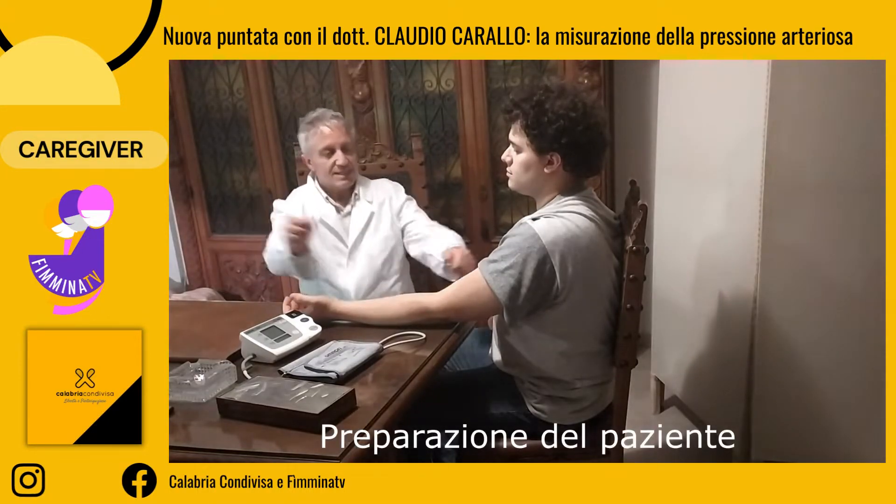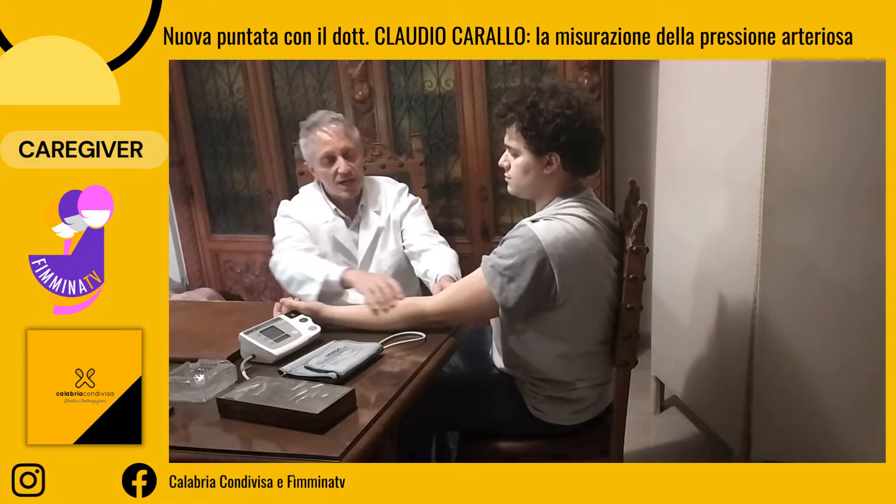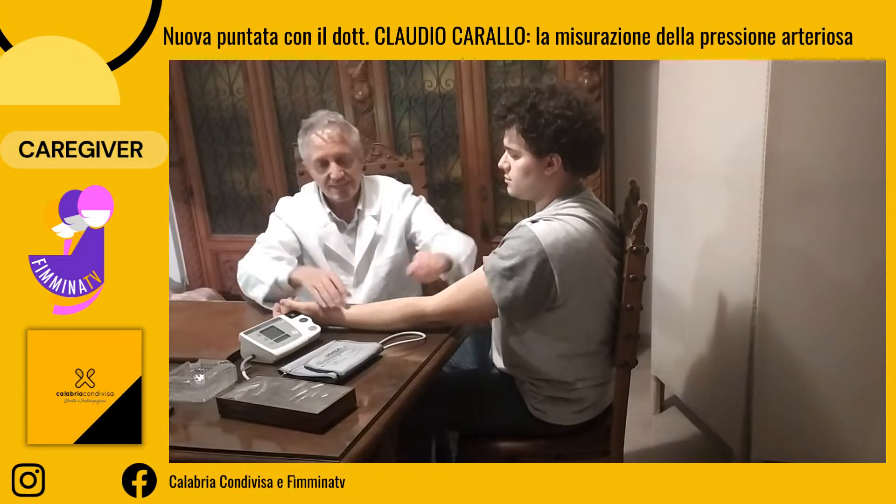Il braccio deve essere scoperto e libero da vestiti, come in questo caso. Il gomito deve essere poggiato su una superficie piana, possibilmente non troppo calda o troppo fredda, e l'avambraccio deve essere scoperto.